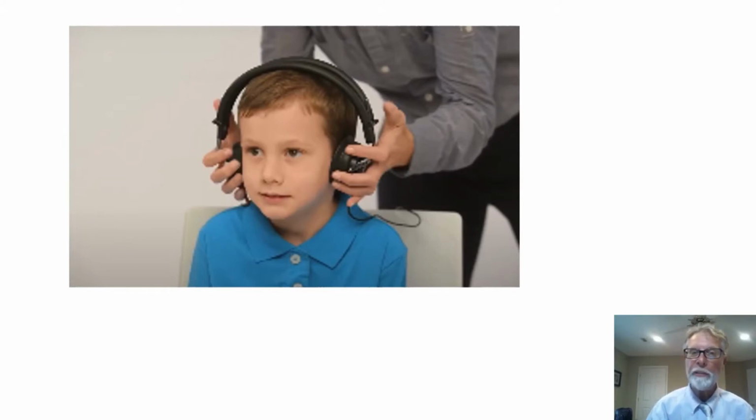And always have the patient facing away from you when you're testing, okay? You want them facing away from you because you don't want them to see what they're doing. And you want them to either push the response switch, if you have a response switch, when they hear the tone, or raise their hand when they hear the tone. And so you tell them they're going to hear some beeping sounds, and they're going to get fainter and fainter, lower and lower in intensity. But no matter how low they are, as long as they're sure they hear it, they are to raise their hand. They are to respond to that stimulus.